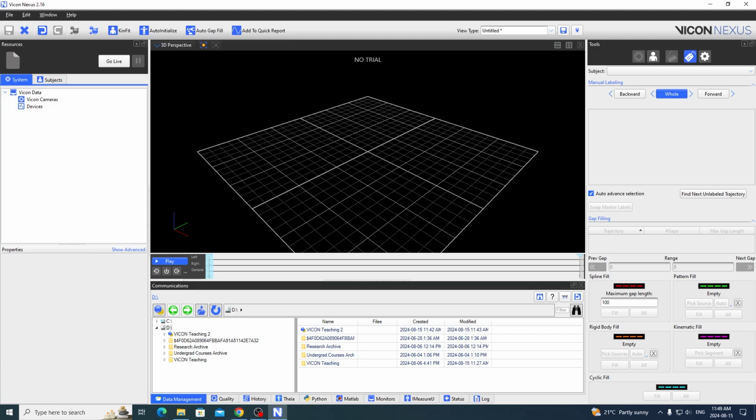To set up the directory for your projects or for your data collection session, you have to utilize Vicon's ProEclipse database system. Vicon does not let you create a new folder and put your data there.